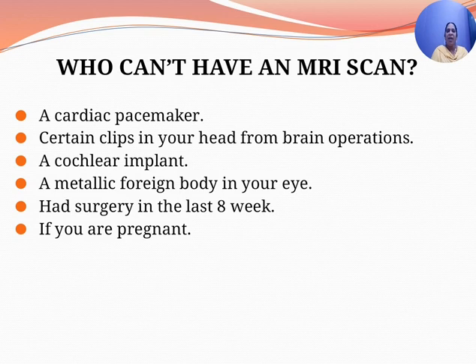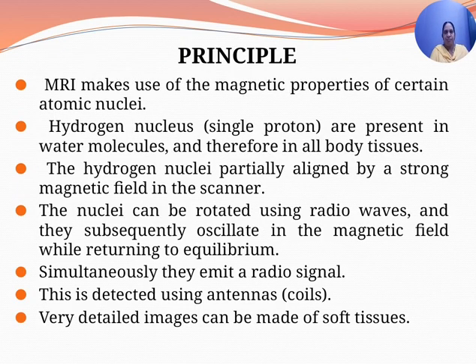Patients having cardiac pacemakers, clips in their head after brain operations, cochlear implants, metallic foreign bodies in the eye, those who had surgery in the last 8 weeks, and pregnant women cannot have an MRI scan. The principle of MRI imaging.